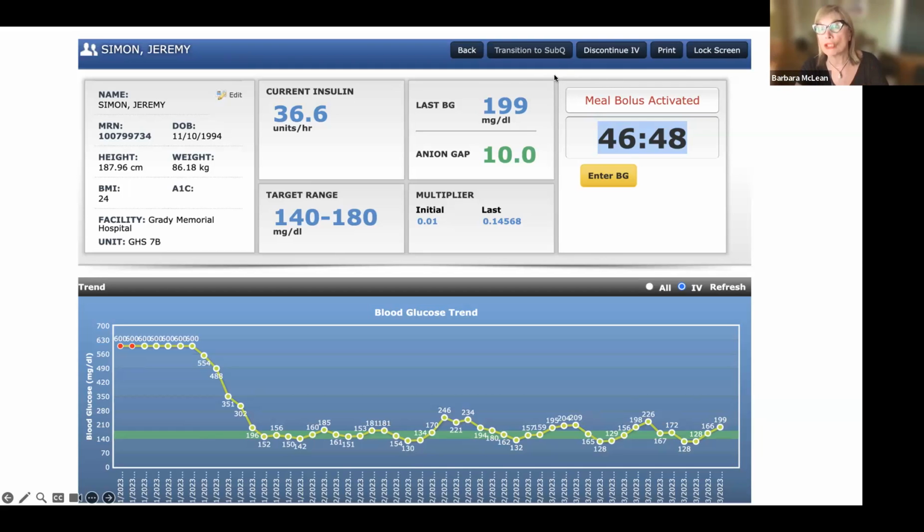It's actually meal adjustment. It's a meal adjustment in insulin where we balance the carbohydrate intake of the patient to the adjustment in insulin to mimic endogenous insulin support. This is incredibly important because when you come and make your rounds, you go, oh my God, he's on 36 units of insulin. Well, that's a good thing.